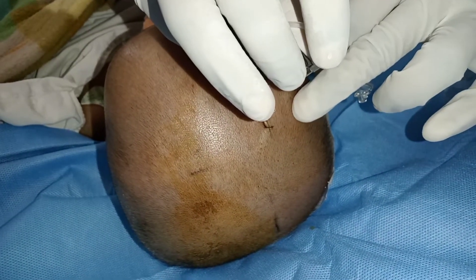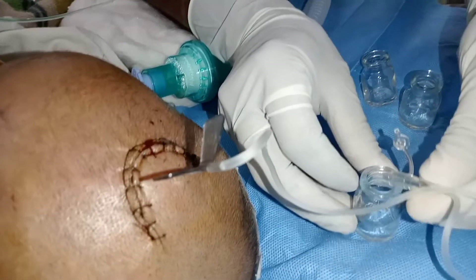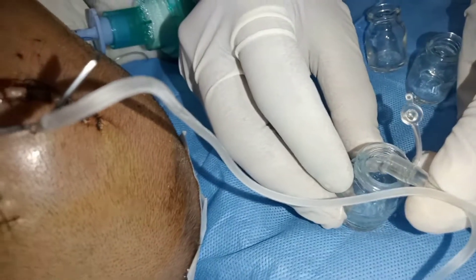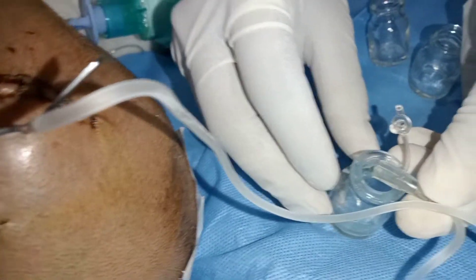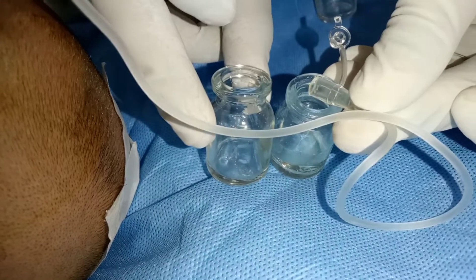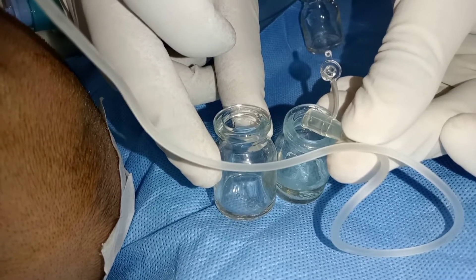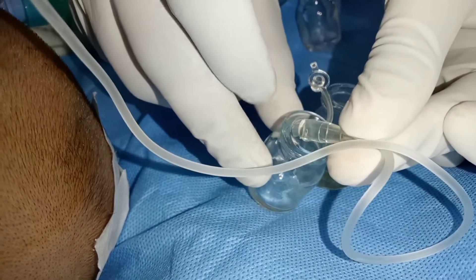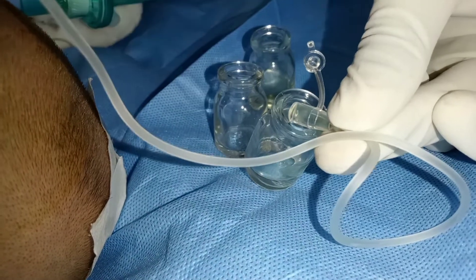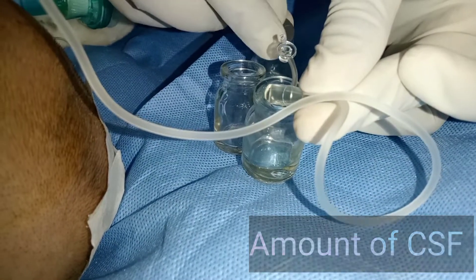The needle of the butterfly cannula is inserted at the mid position of the suture, perpendicular to the scalp. Just after insertion, we see the CSF coming out through the tube and being collected in the CSF collecting vials. We collect CSF in multiple vials to send for diagnostic routine tests and also to relieve intracranial pressure. The amount of CSF to be taken out is guided by the patient's age and underlying condition.